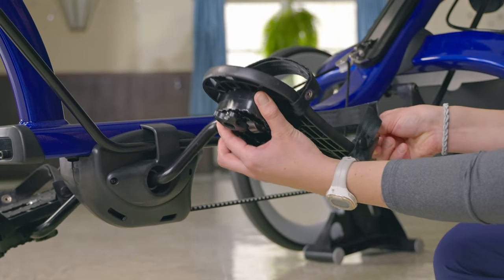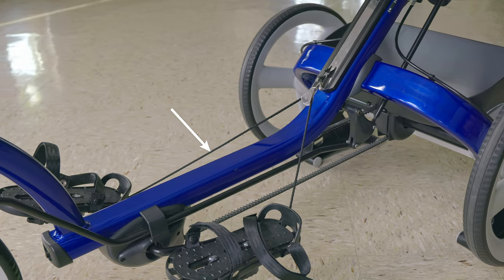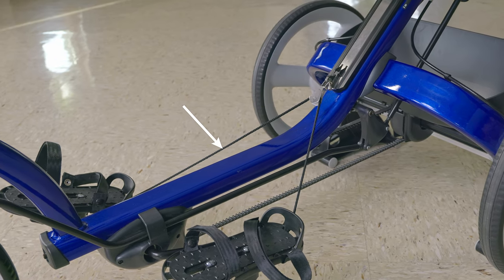Now, I'd like to show you the adjustments on the pedals. We can loosen these knobs to move the sandals forward and backward on the pedal crank. For a rider with strong extensor tone, we might put the axis of rotation under the ball of the foot to maximize the force from their plantar flexion tone with each pedal stroke. Or we can move the sandal forward. This string keeps the pedals level when the trike is not in use.